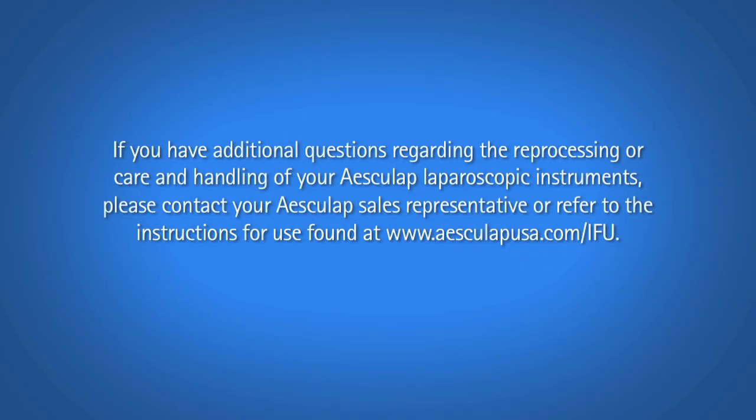If you have additional questions regarding the reprocessing or care and handling of your Aesculap laparoscopic instruments, please contact your Aesculap sales representative or refer to the instructions for use found at www.aesculapusa.com/IFU.